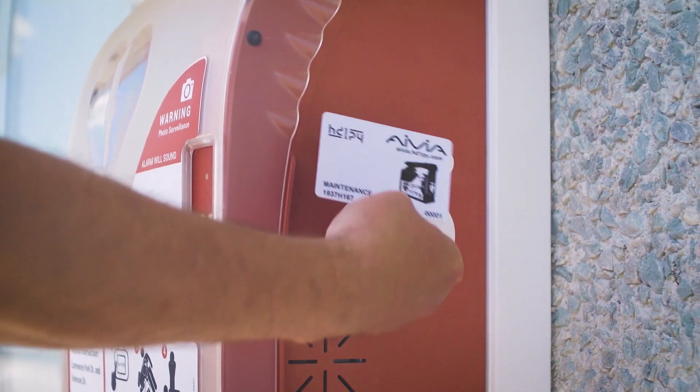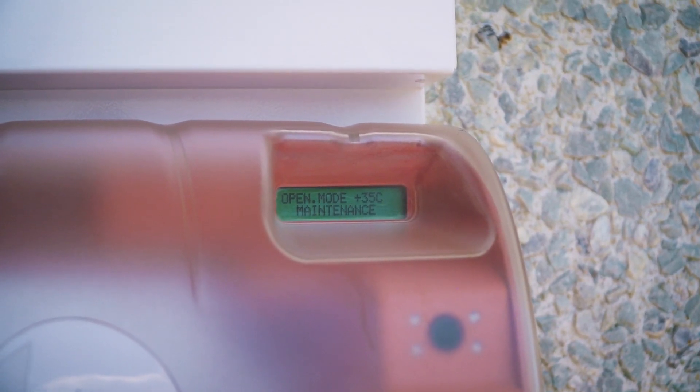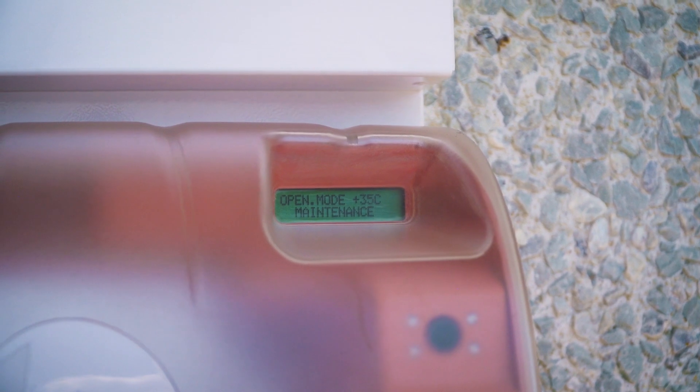If you are resetting the cabinet or decide not to open the cover, the cabinet will automatically rearm itself after 10 seconds and will beep six times.